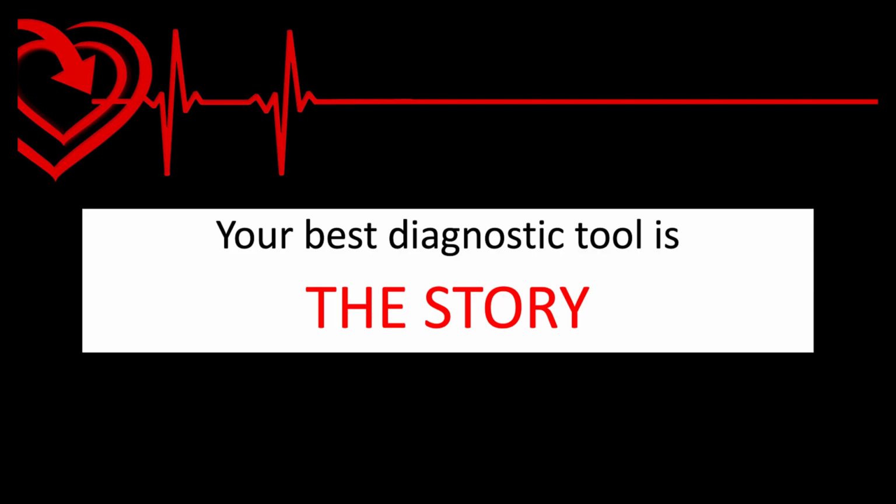And above all, pay attention to the story. If the story fits and you think your patient is having an MI, provide the best cardiac care you can and get them to the right resources. If this patient's story doesn't sound like an MI, don't get fooled by the machine. Don't get fooled by a tracing into trying to make it into something it's not.